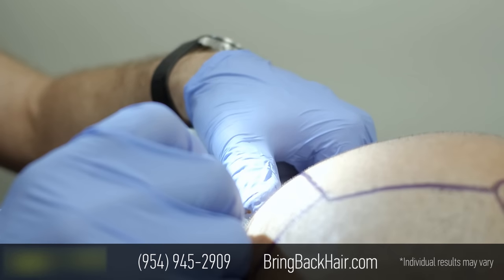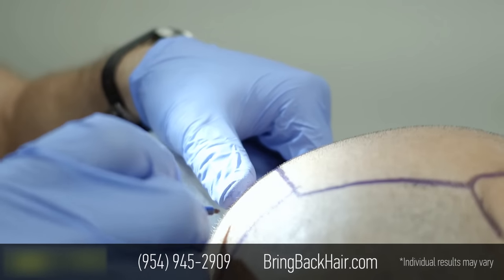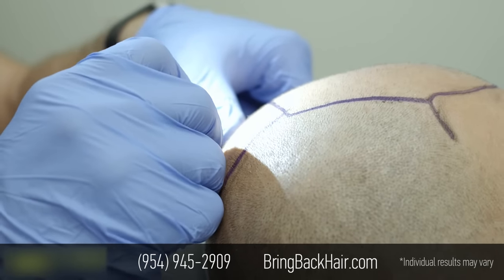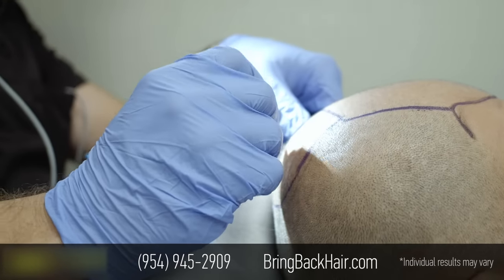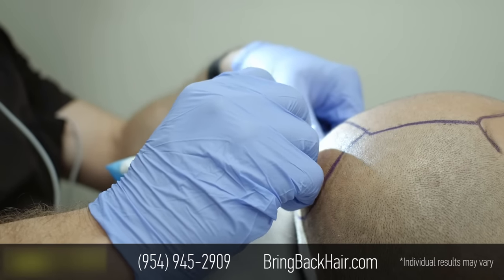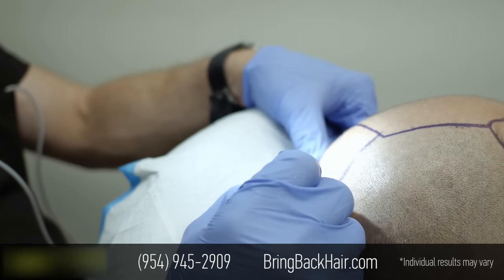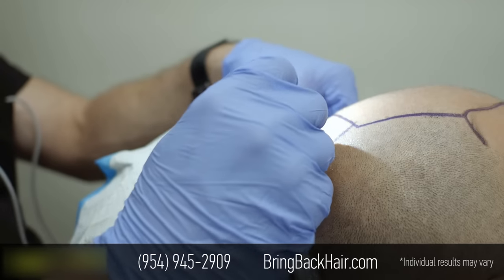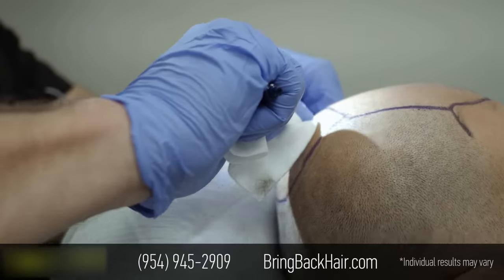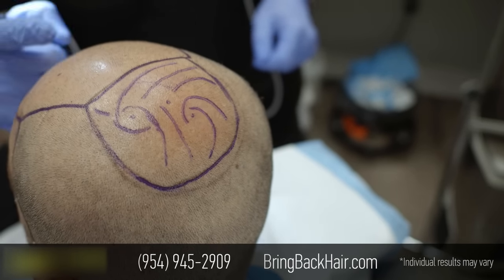I'm going to start by looking with my microscope magnifying glasses to see the different hair directions. I'm going to create a pattern to highlight the different hair directions, and when I place the incisions, it's going to help me to follow it, so the back of the head will look completely natural.